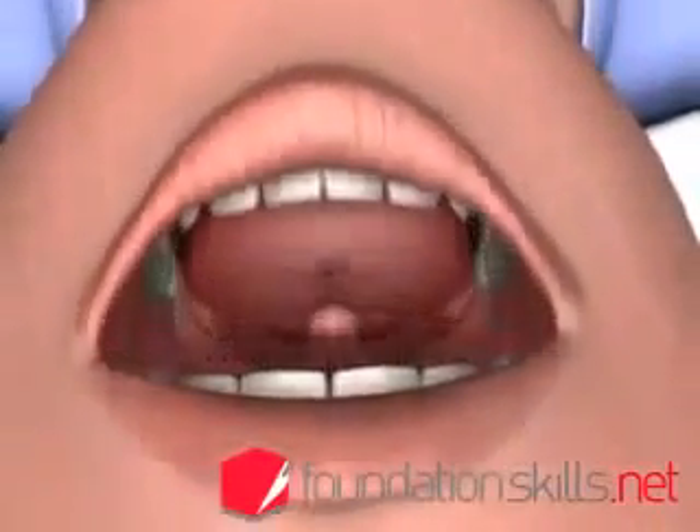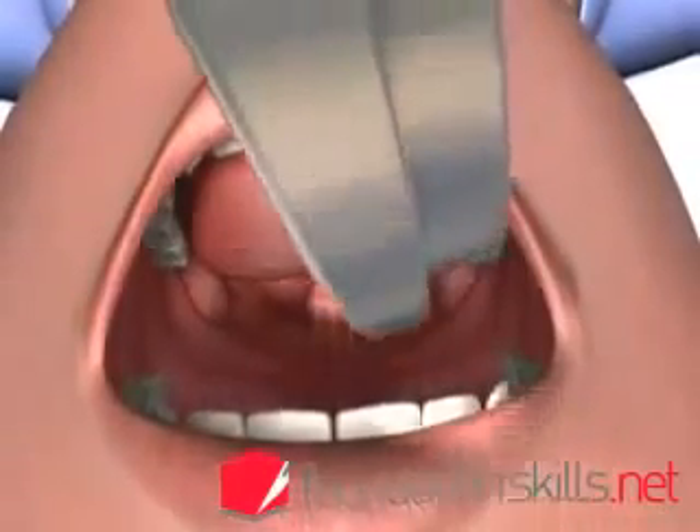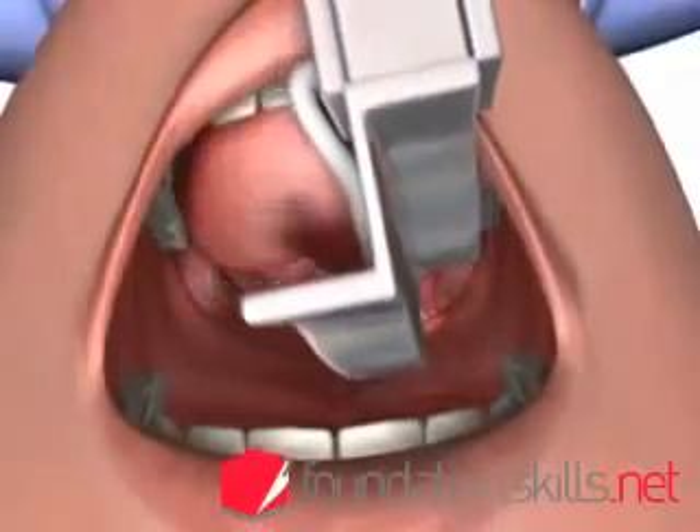With the head in the sniffing the morning air position, with the left hand, insert the curved blade of the laryngoscope into the mouth over the right side of the tongue, displacing it to the left and upwards.